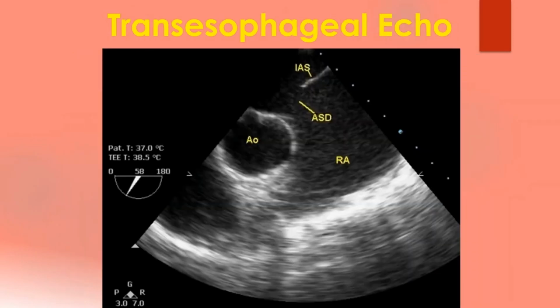The images shown so far were from transthoracic echocardiography. Another mode is transesophageal echocardiography, in which the echo probe at the tip of an endoscope-like device is introduced into the esophagus. As the esophagus is just posterior to the heart, image quality is excellent. Shorter distance permits the use of higher frequency transducers which give better image resolution. Higher frequency transducers have only low depth penetration and are not suitable for transthoracic echocardiography.